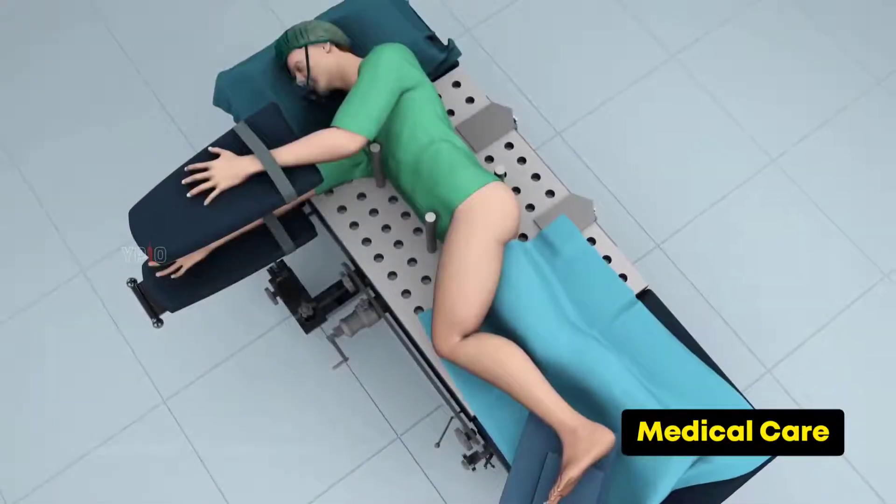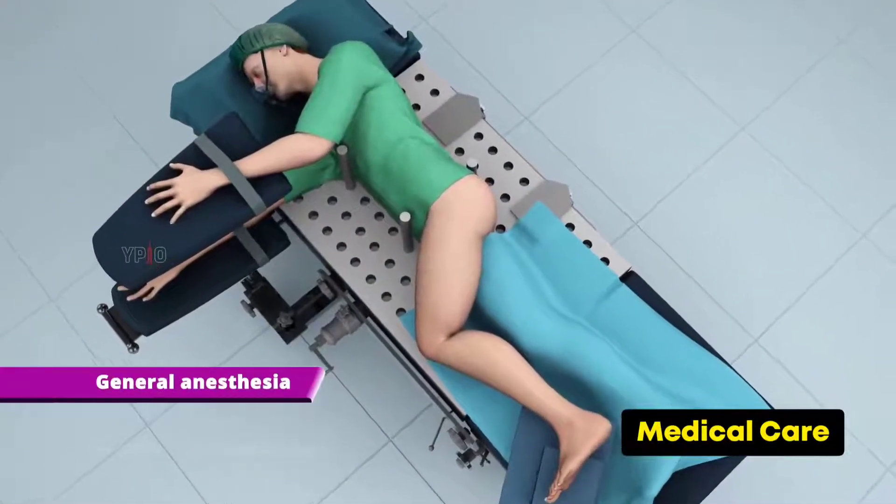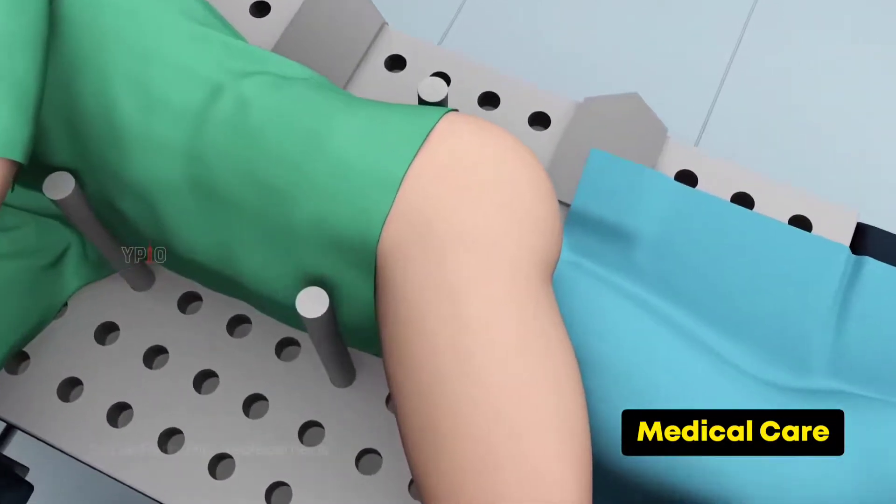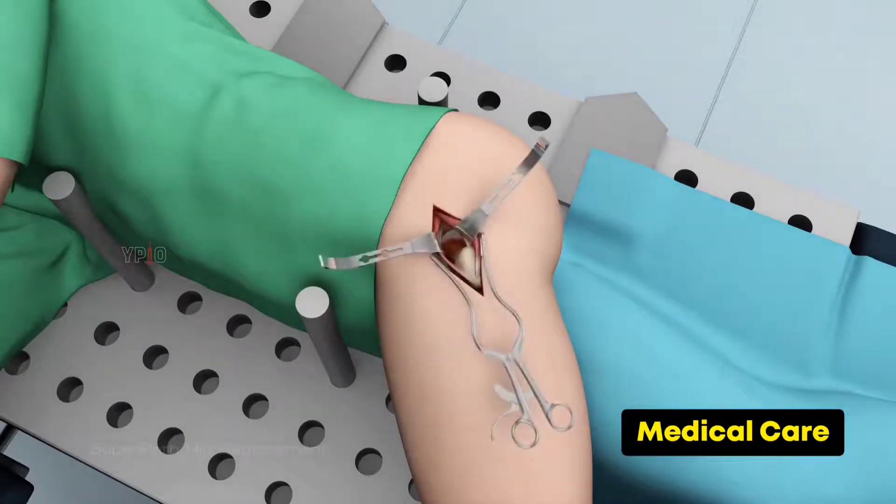Super path hip replacement is performed under general anesthesia. You will lie on your side for the procedure. A two to three centimeter incision is made on the side of your hip. Your surgeon retracts the buttock muscles and tendons.